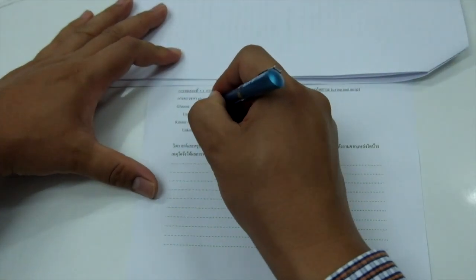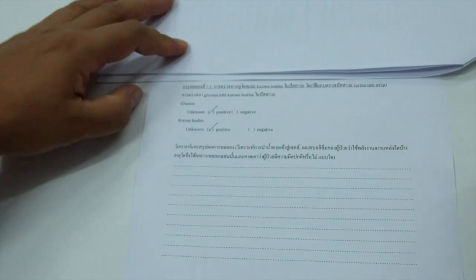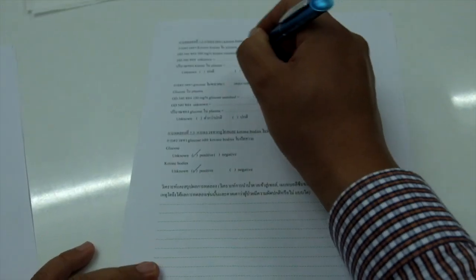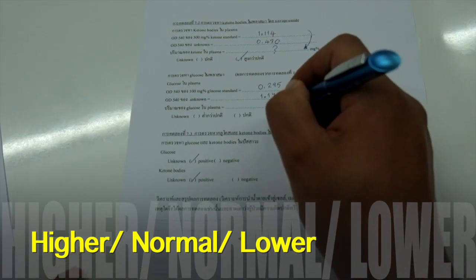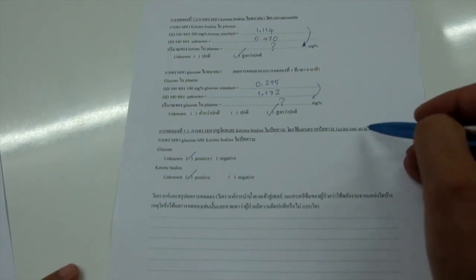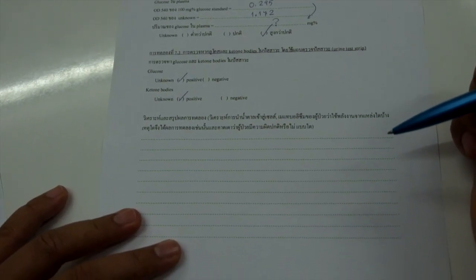After the levels of blood glucose, blood ketone bodies, urine glucose, and urine ketone bodies are reviewed, compare those levels with the standard range. Identify each value, whether it is higher than, lower than, or in the normal range. Finally, hypothesize whether all the results are the likelihood of which of the cases reported in your laboratory manual. That's all.